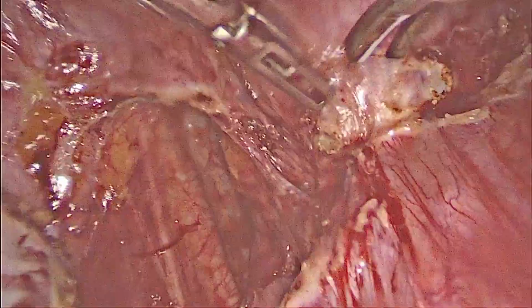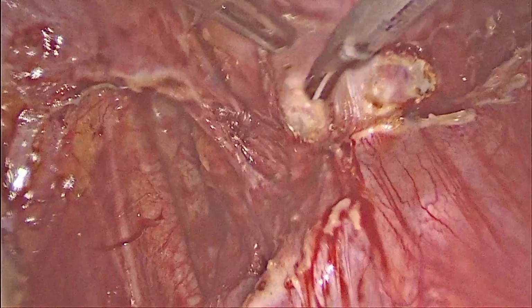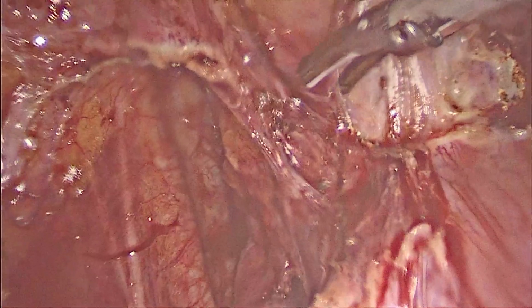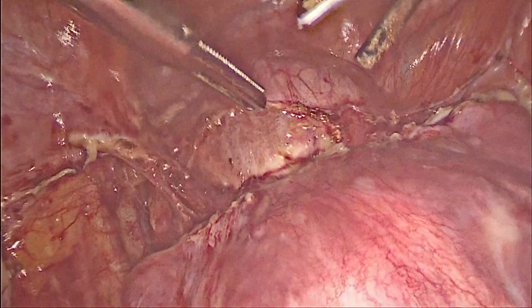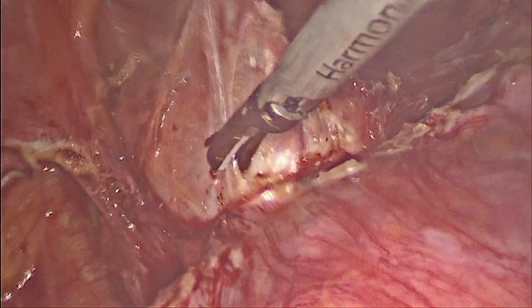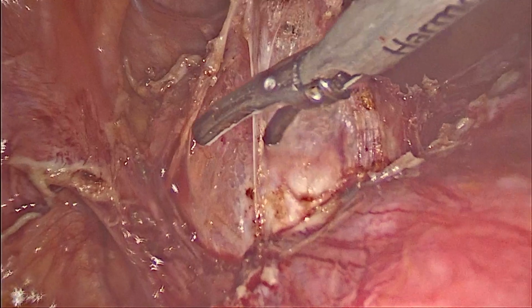So this fibrous tissue from the previous cesarean section scar is being divided.